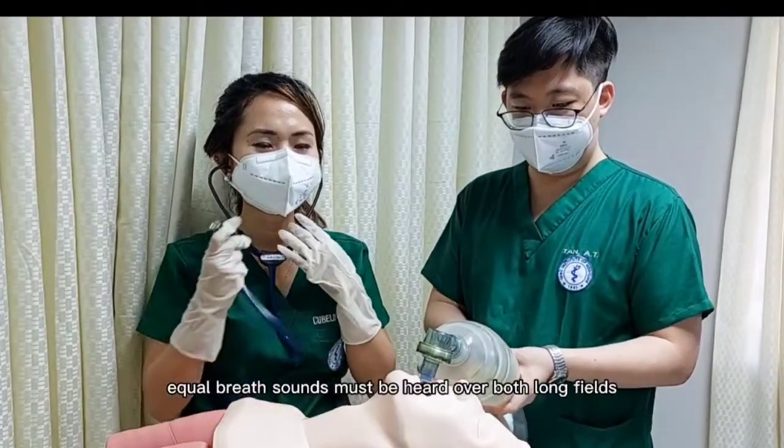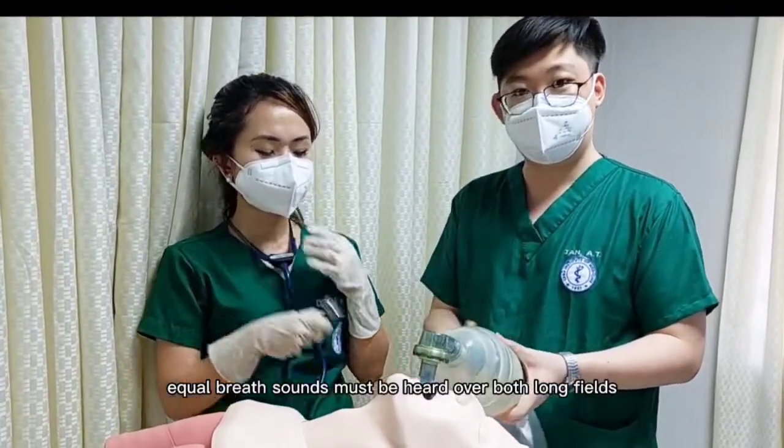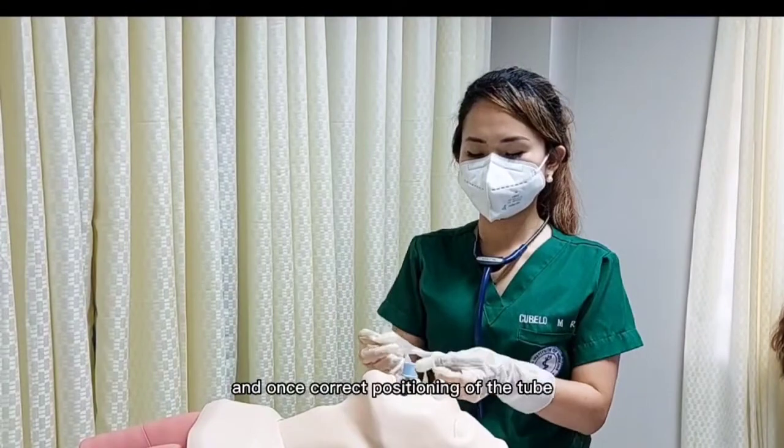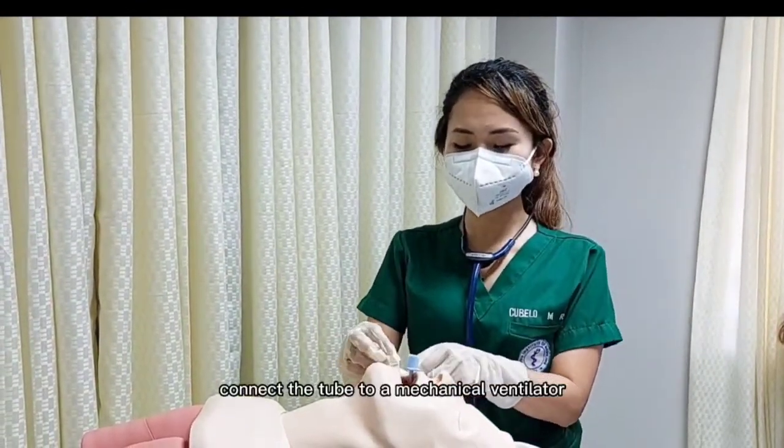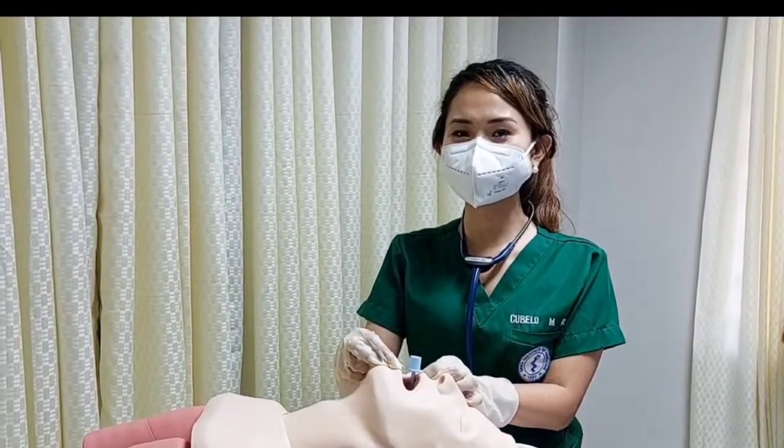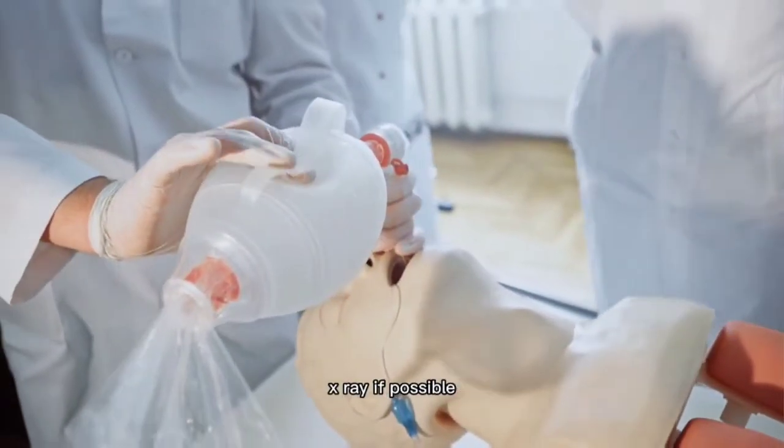Equal breath sounds must be heard over both lung fields. And once correct positioning of the tube has been confirmed, connect the tube to a mechanical ventilator and plaster the tube in place. You can obtain a chest X-ray if possible.